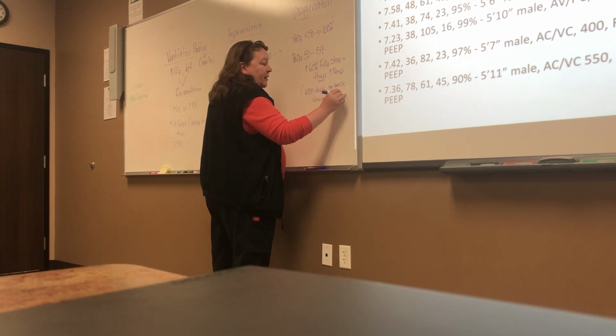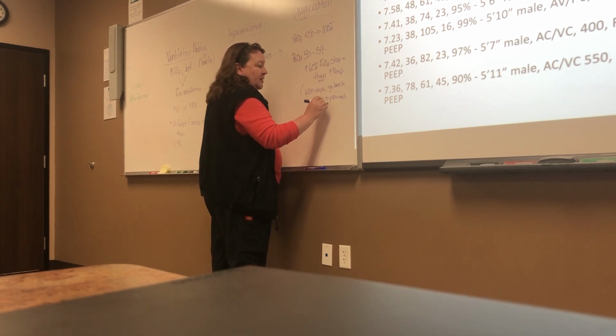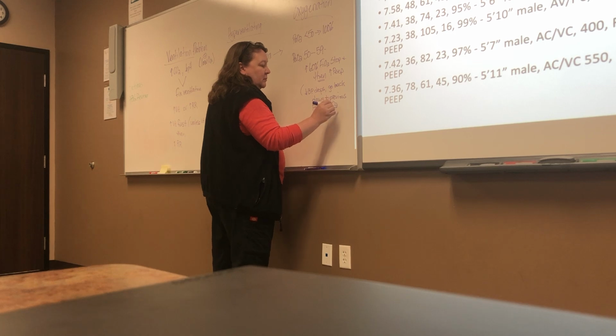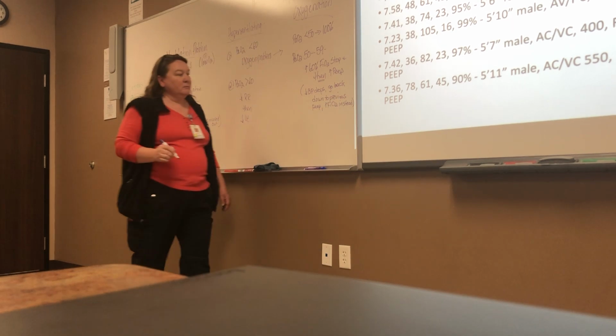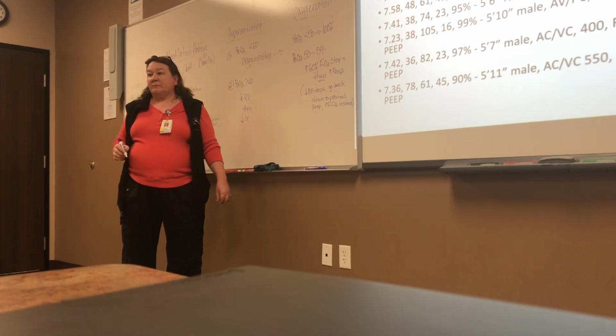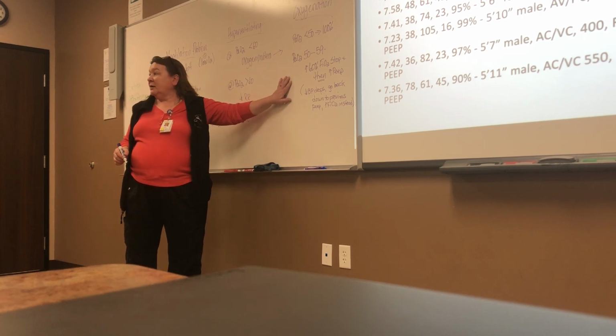If you're going up on your PEEP and your blood pressure drops, go back down to the previous PEEP and start increasing FiO2. Everybody good with this so far?